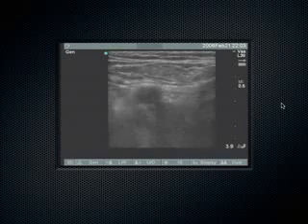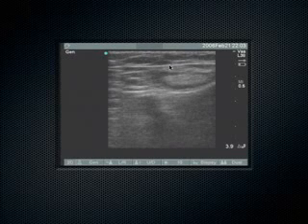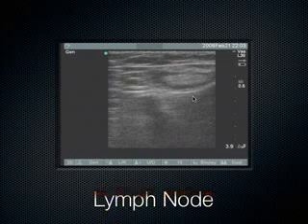And then you see that thing up there. What is that thing up there? See, look, there it is, right there. This is a very enlarged lymph node. And we see that in cases of infection. So there's an infection downstream, down the leg, maybe around the lower extremity, somewhere around the calf or something. It's all red, the skin's kind of red, the leg is kind of swollen, and then you don't see DVT, but you see a really enlarged lymph node. It helps sway you clinically towards cellulitis or infection and away from DVT.